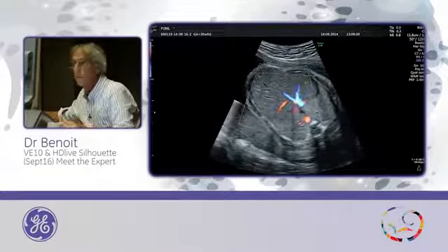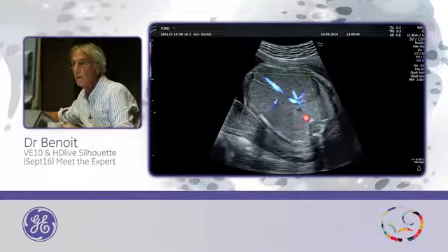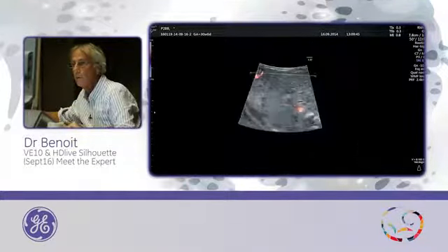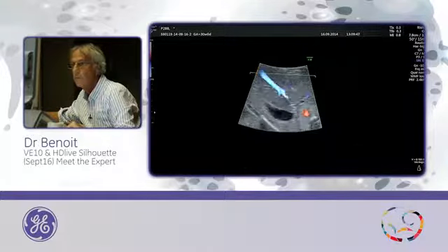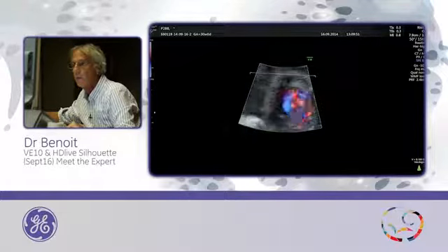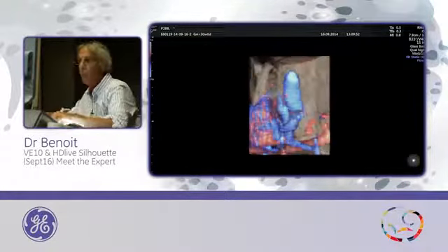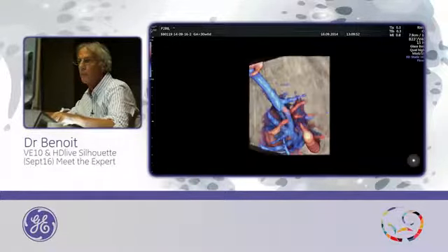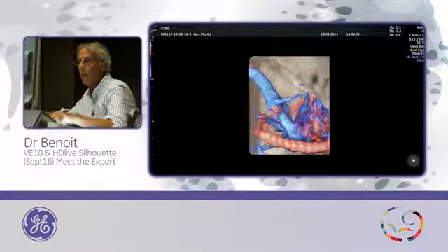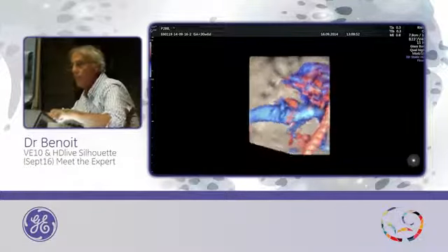And start 3D with glass body, start. And this is the result. It's a monochromic color.